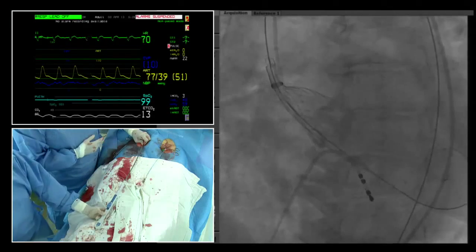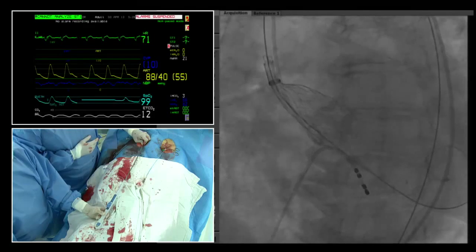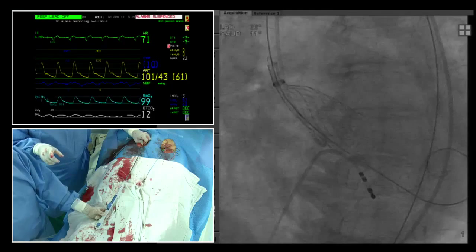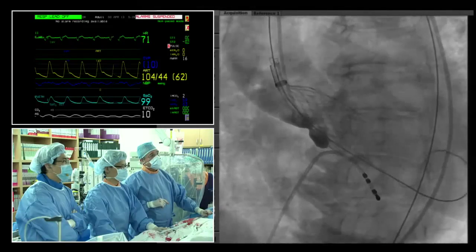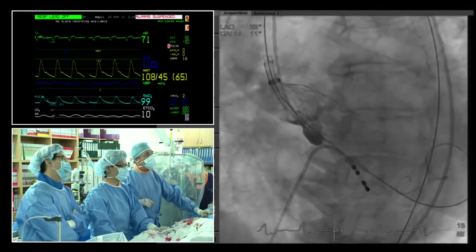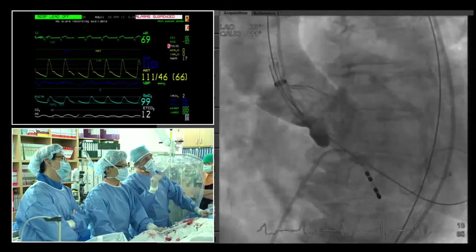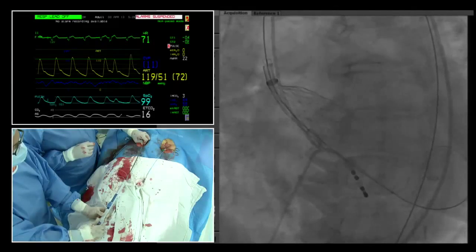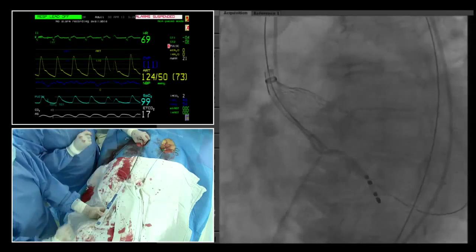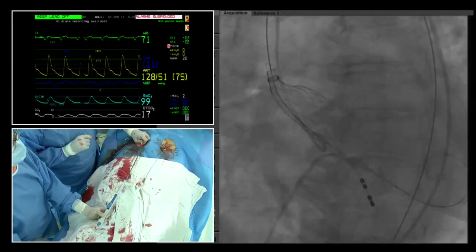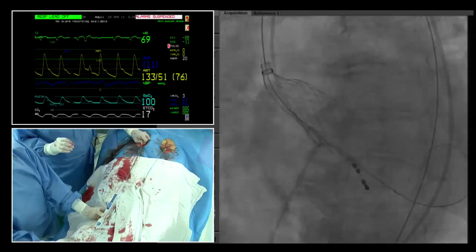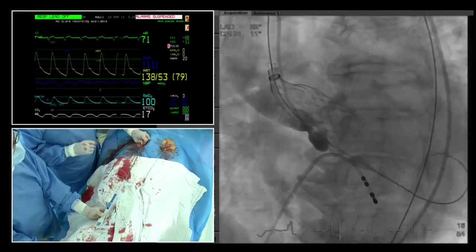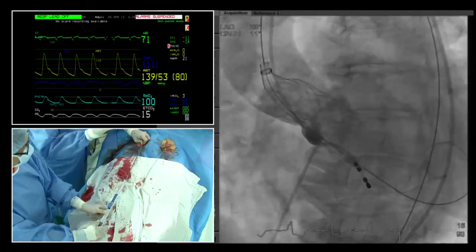Pacing is decreased. Pressure recovers to approximately 80–85 mmHg with the pigtail still in place. An angiogram is performed to check valve position. The valve appears to be in a good position. The frame is expanded further slightly to better assess the distance from the left main ostium. The angiogram confirms adequate space between the frame and the left main — good clearance confirmed.